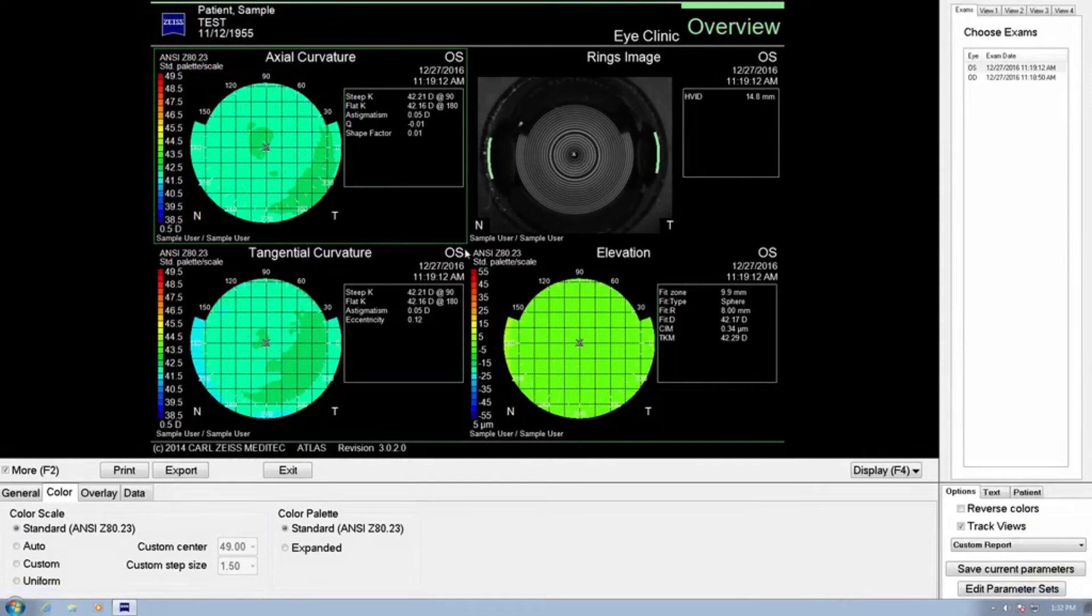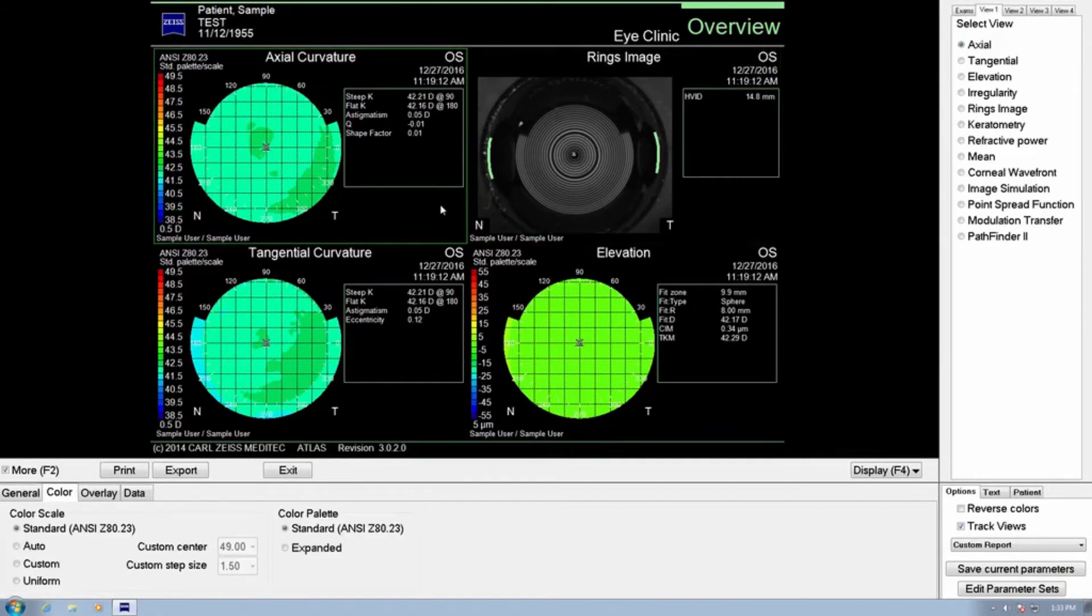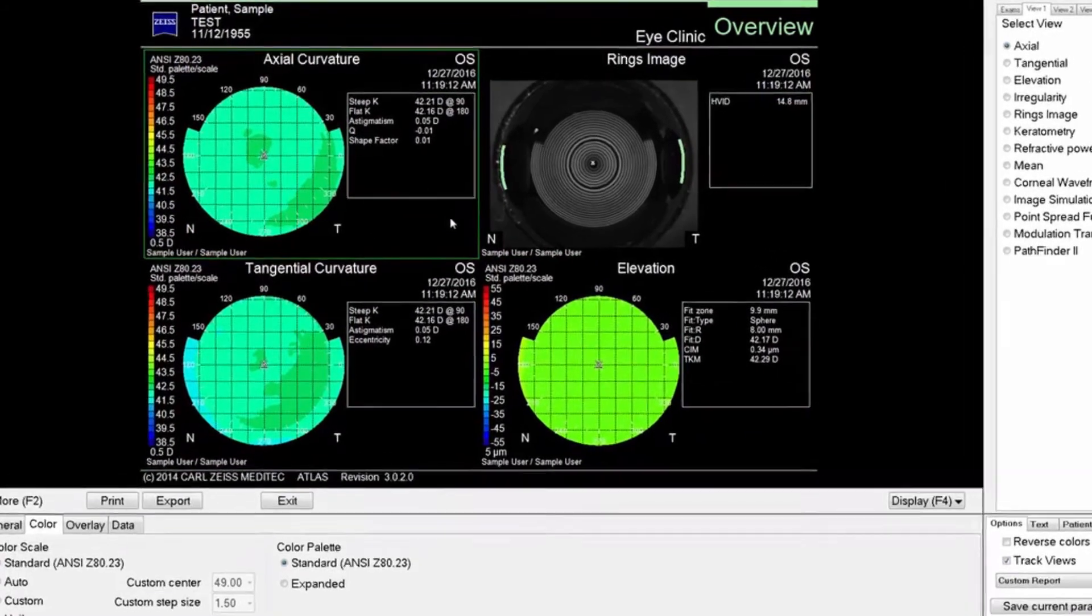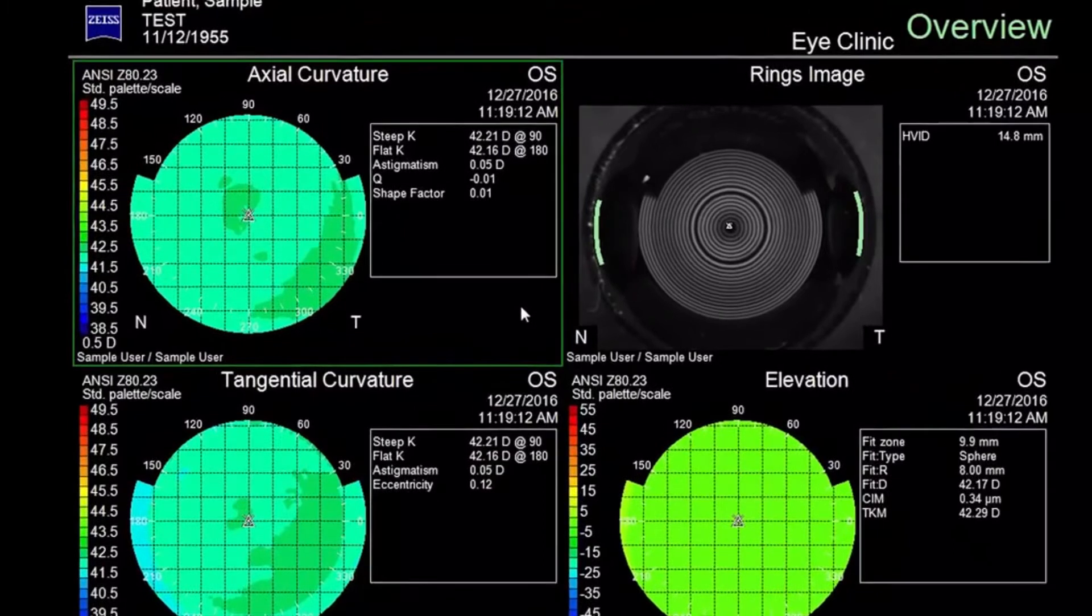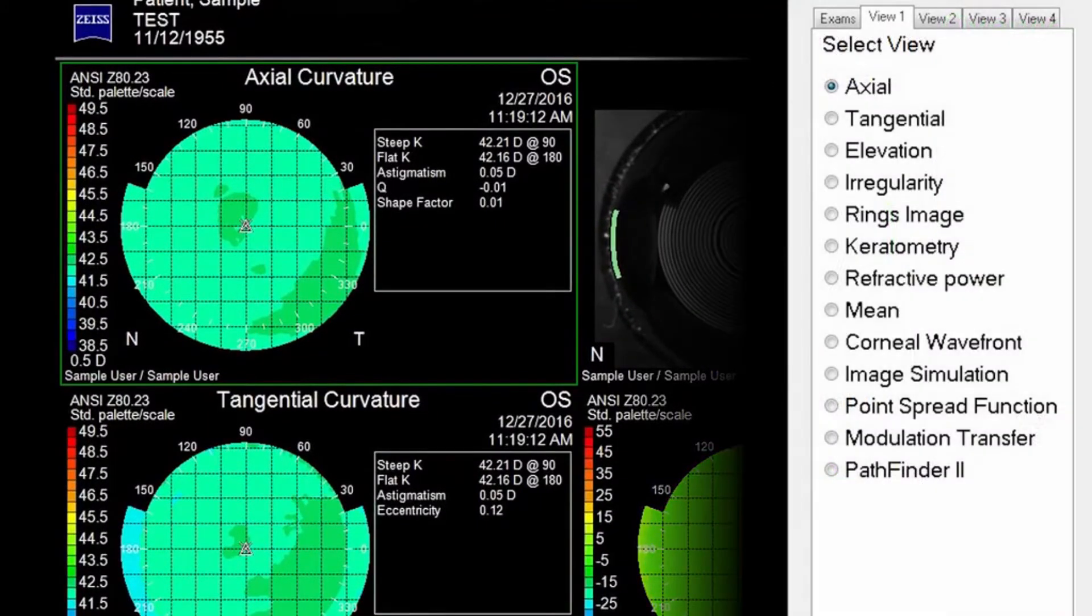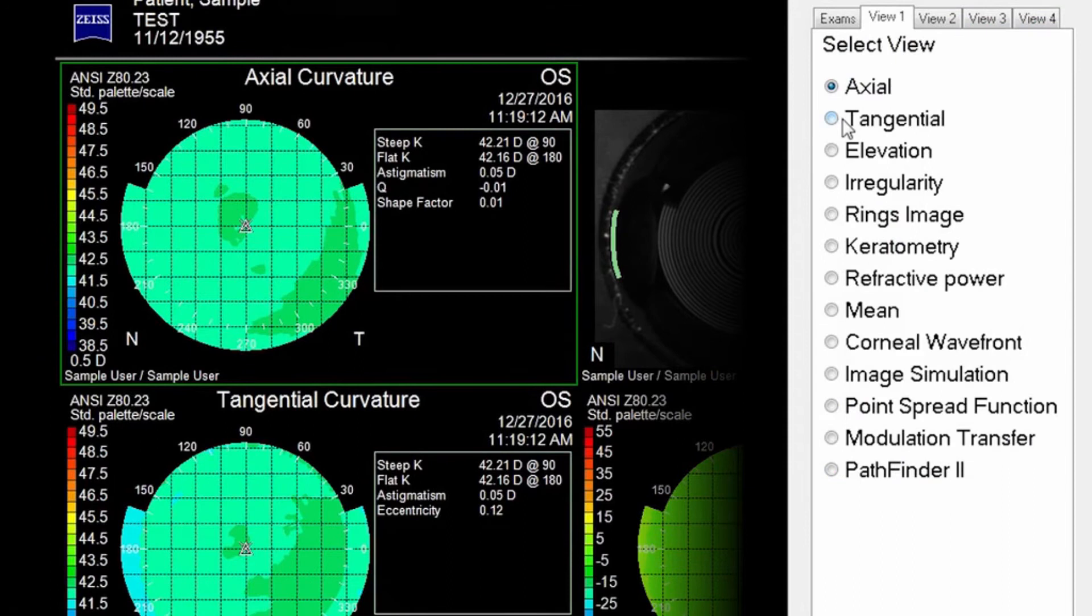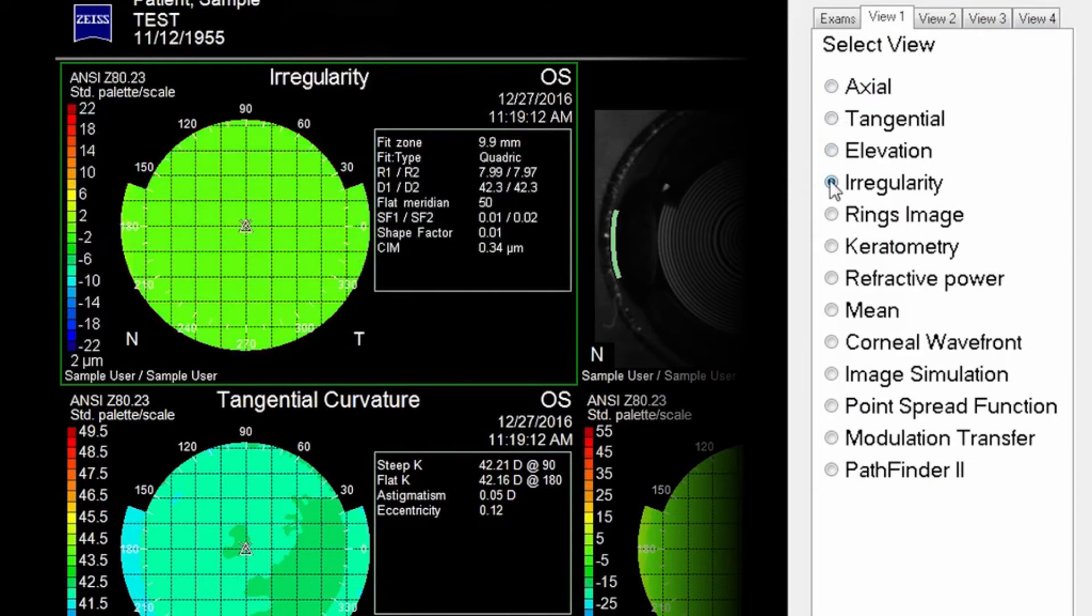Each of the quadrant views can be individually customized with unique display parameters. You want to click on the first quadrant you'd like to customize. When selected, a green border highlight will appear. The corresponding tab view on the right will become active and show a list of reports that can be selected. Click on the view you want.